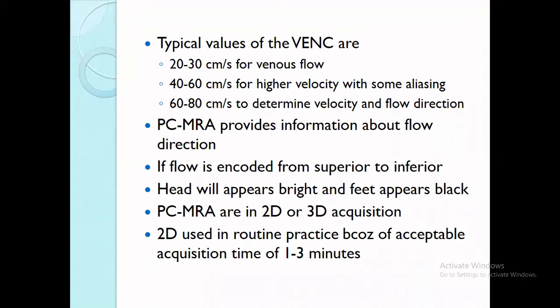So why are we using two-dimensional imaging at certain times? We use it because we want to see the particular type of imaging in a very short time. That's why the acquisition time for this one is 1 to 3 minutes, which is less. We have a patient burden in the hospitals as well. So you have both options. If you are working in a standard way of examination of the patient, it should be three-dimensional, because three-dimensional can give you a lot of information.